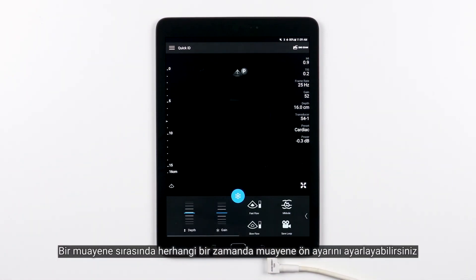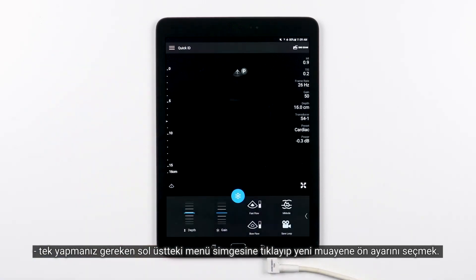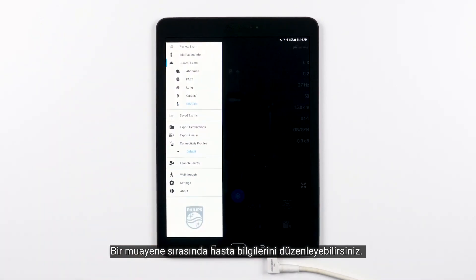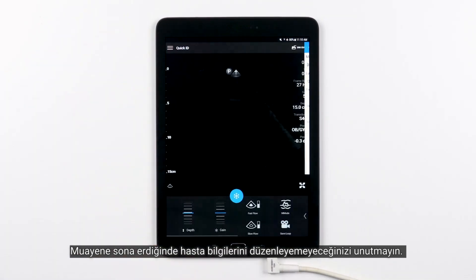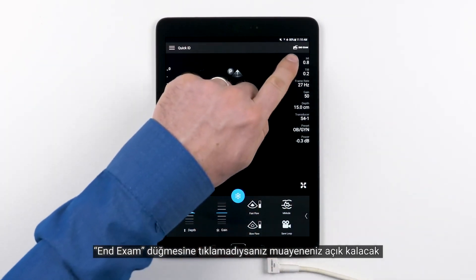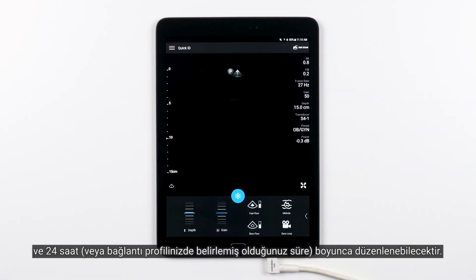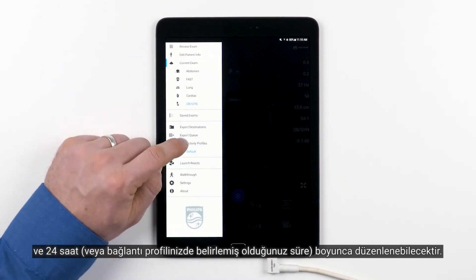You can adjust the exam preset at any time during an exam. Just tap the menu icon on the top left and select the new exam preset. During an exam, you can also edit the patient information. It's very important to remember that once the exam is ended, you are no longer able to edit the patient information. If you don't tap the End Exam button, your exam will remain open and editable for 24 hours or for whatever duration you have set within your connectivity profile.